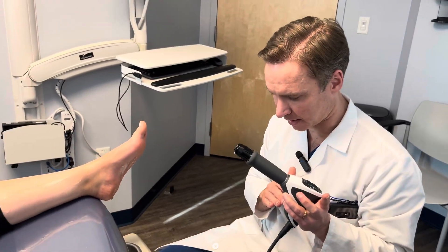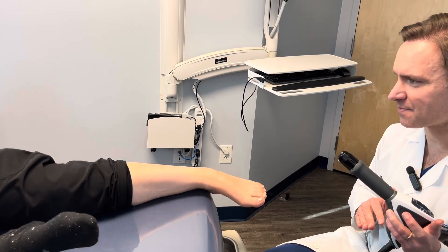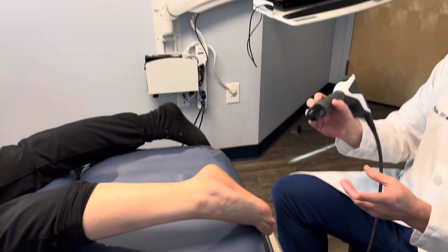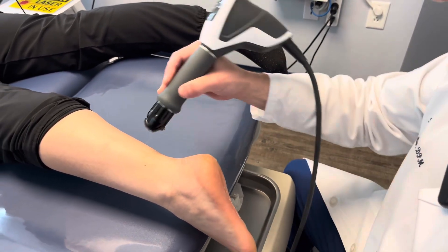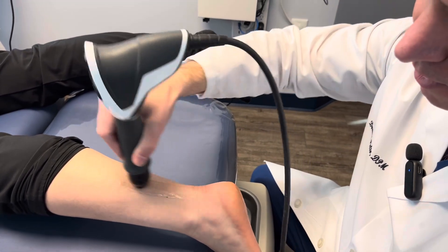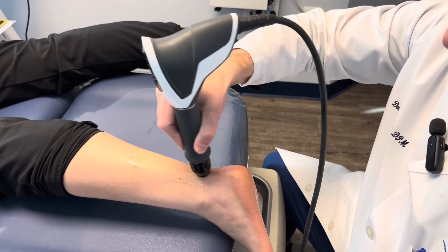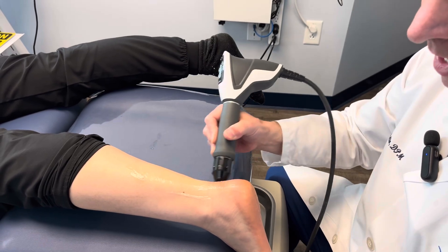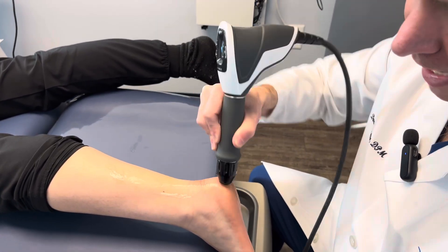Now I'm going to have the patient go on her stomach to show how to do the Achilles. The way I do the Achilles is similar — I have them down with their foot down. You would do an area about the size of a dollar bill and make sure you have enough ultrasound gel. The area that is very painful is going to be the insertion of the Achilles right down on the bone. I'm using the cobalt tip here, so it's okay. I go up and down the area for about 2000 pulses.